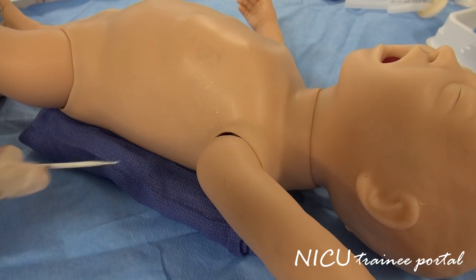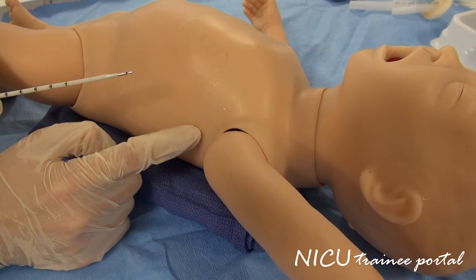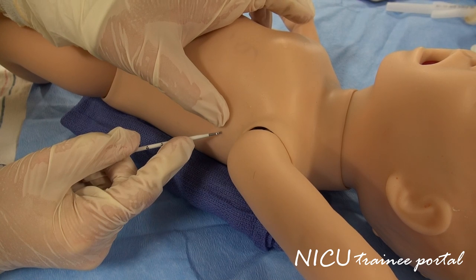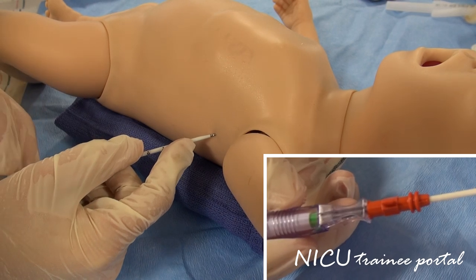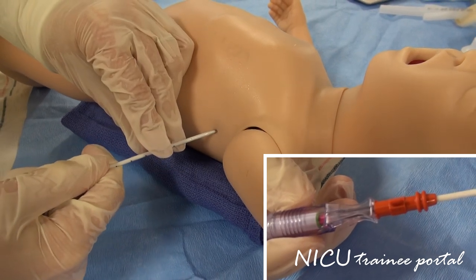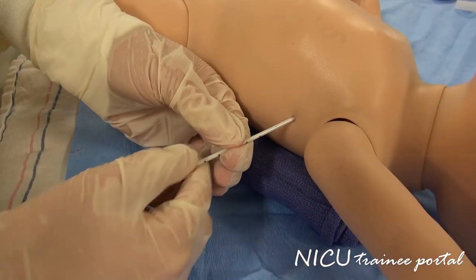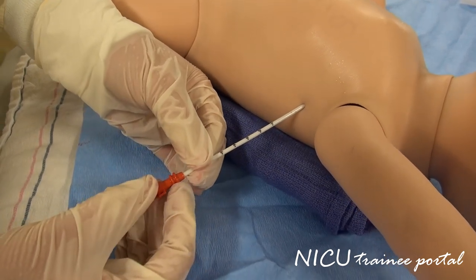We will now insert the chest tube. Again, identify your landmarks. You go directly above the rib and advance until you see the hub turn green. You will then want to insert your chest tube another two to three centimeters.